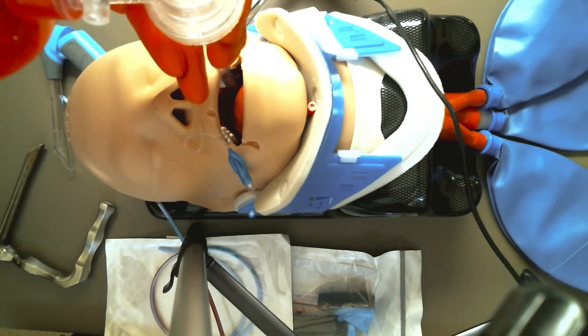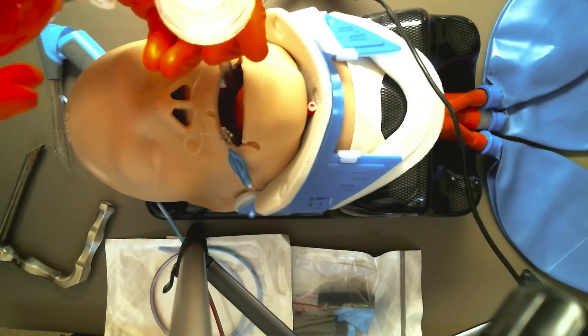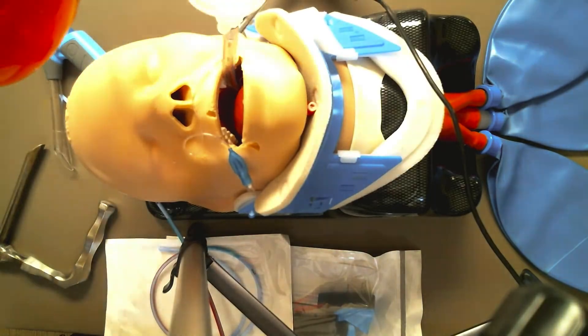Now a quick look from the inside. We'll put a little endoscope inside the V-scope.